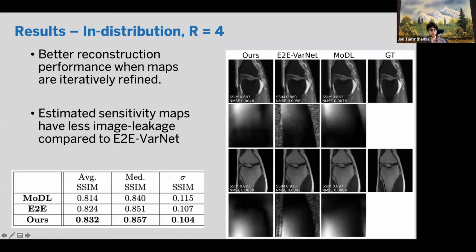Okay, so the question is, what's the best loss metric? And this is really an open problem. We're using SSIM, you can tell that this table was cropped. So we also have other quantitative metrics to show, and we're improving on all of them. But the quantitative metrics somewhat miss the story. Ultimately, we need to see how they perform under a diagnostic setting. Now, you could tune it a little bit, and you could add an L1 loss as well to the SSIM. That's something that's done in practice, but we just kept it simple. So I believe that the trends will follow a similar path if you change the loss functions a little bit like that. But in this particular case, we only used SSIM for training.